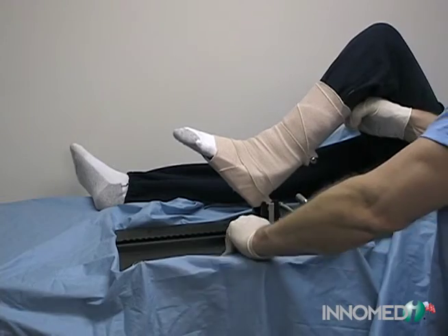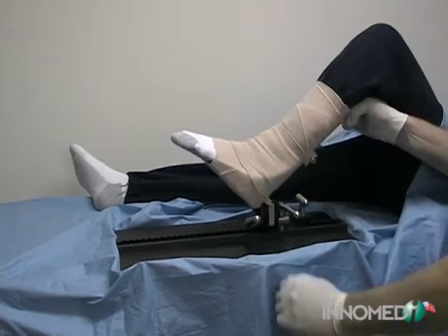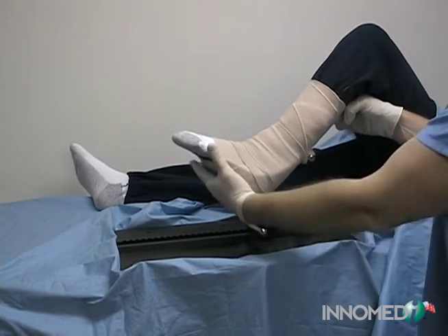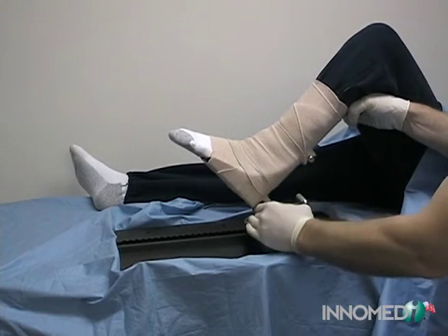The tilt bar allows the yoke to be tilted in either direction. Loosen the bar, adjust the yoke, and tighten to lock in place. The rotation bar allows the knee to rotate or pivot by loosening the bar. Tightening the bar locks the rotation position.